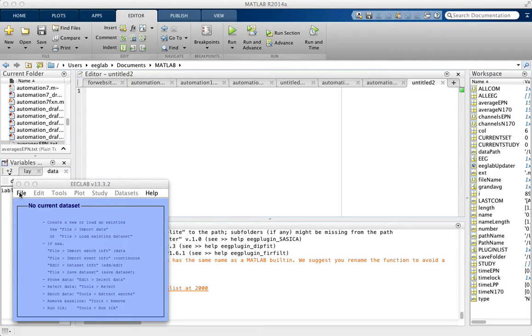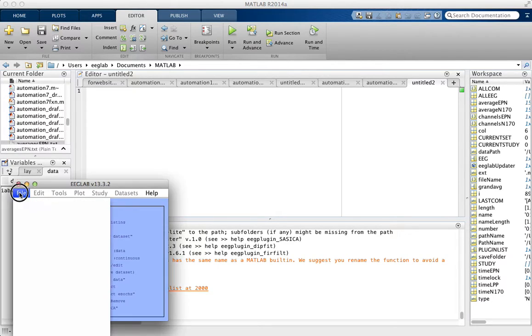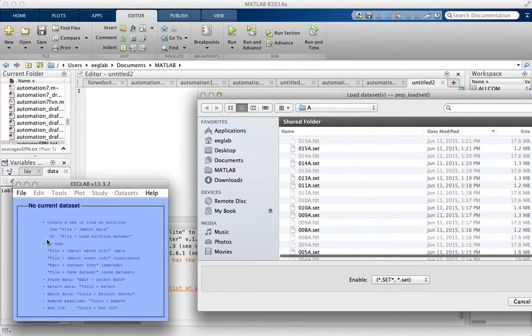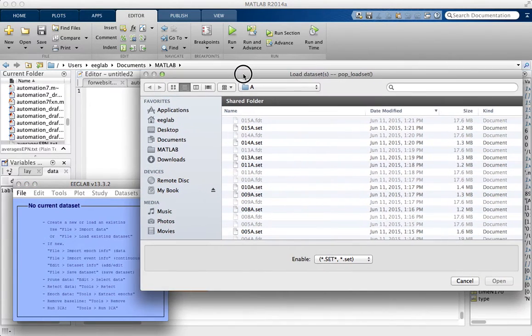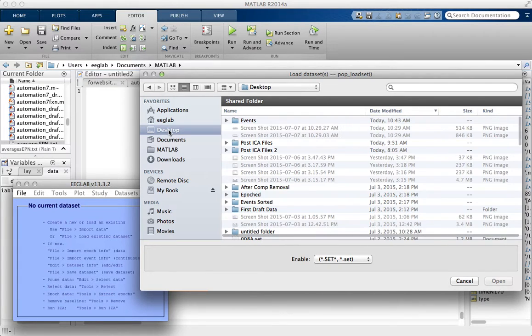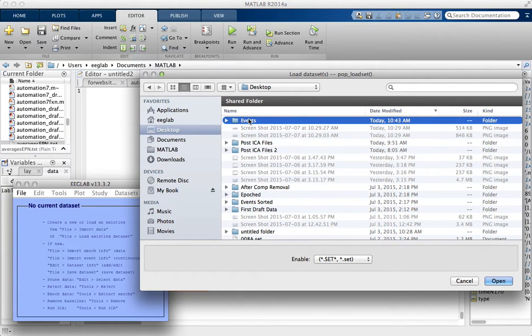First we need to load the data, so File > Load Existing Dataset. These data are on the desktop in the events folder.